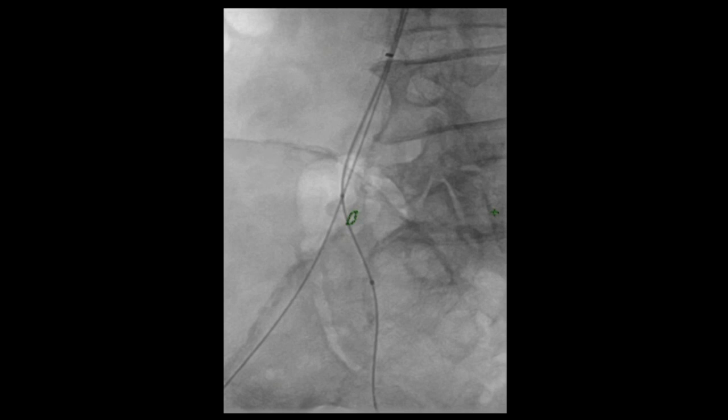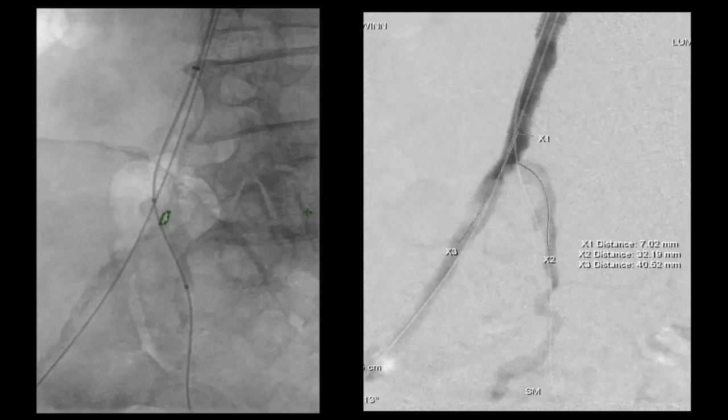You can see it being inflated in the internal iliac artery. As you would notice from the CT scan, it's a fairly long segment stenosis which was present here. The balloon was dilated up to its profile and deflated, and then replaced with the VBX.